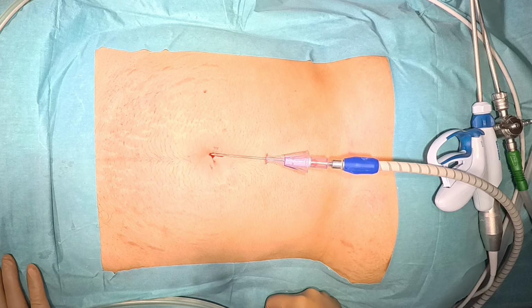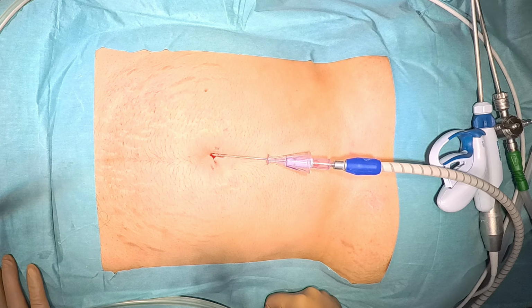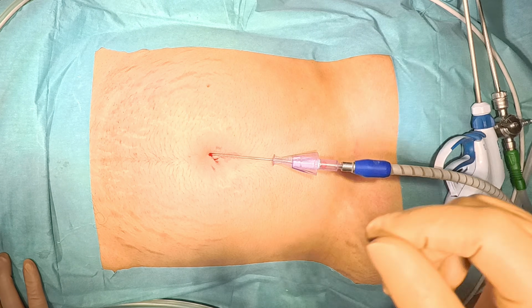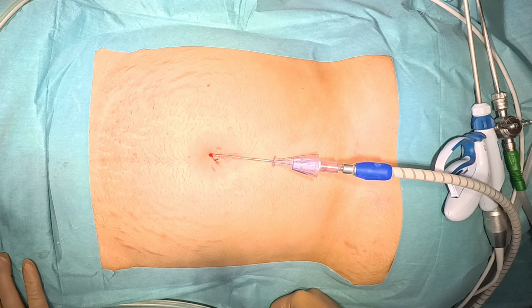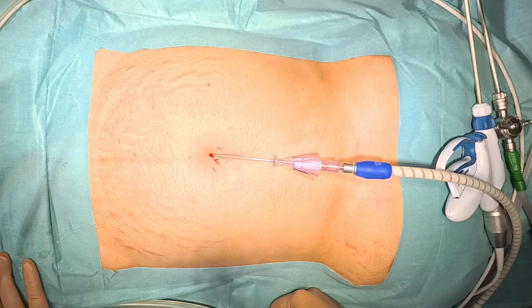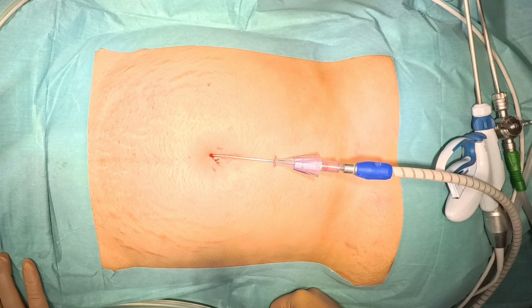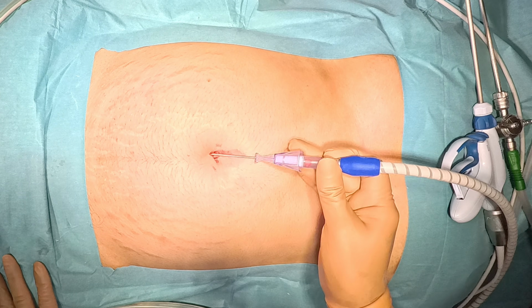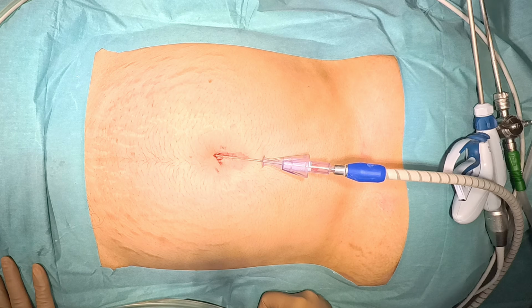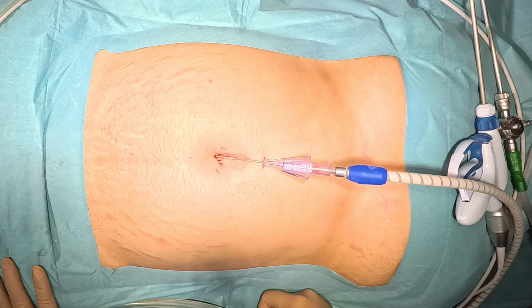The average amount of gas required is minimum 1.5 liters and maximum 3 liters so that the actual pressure can reach the preset pressure. Our eye is on the quadrometric indicator of the insufflator and we can see that homogeneous distension has already started and the abdomen is getting distended with CO2. Once the full distension happens and the actual pressure reaches 15 millimeters of mercury, we will remove the Veress needle.